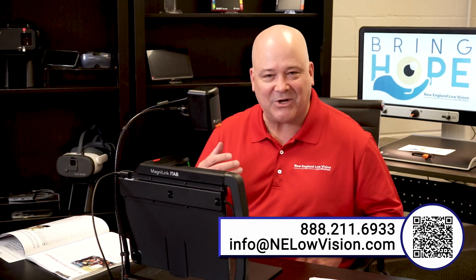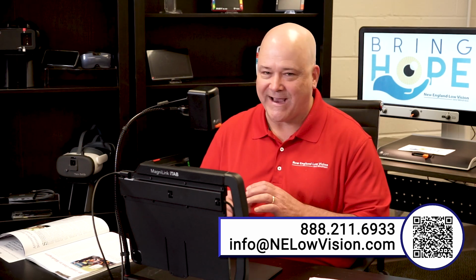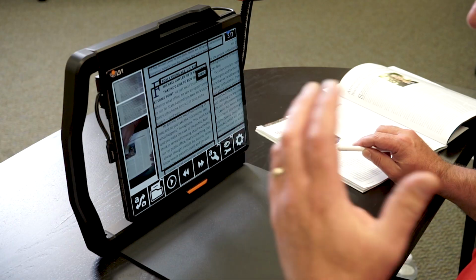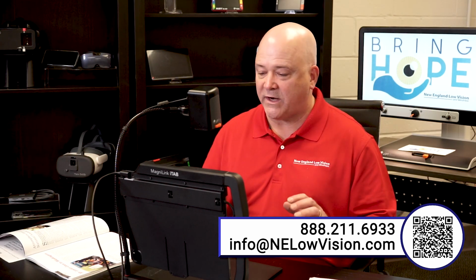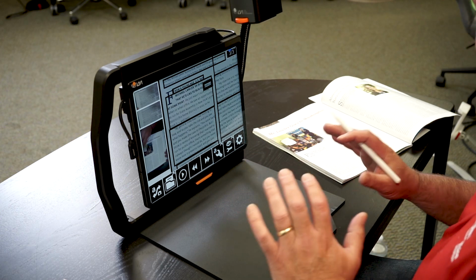And so I don't know if you're like me, but I hate waiting for my technology. So what I like about all of LVI's technologies is that you're not waiting for it. It is in line with the way that your mind thinks. It just moves quick, whether you want to do gestures, whether you want to do keystrokes, whether you want to tap on it.